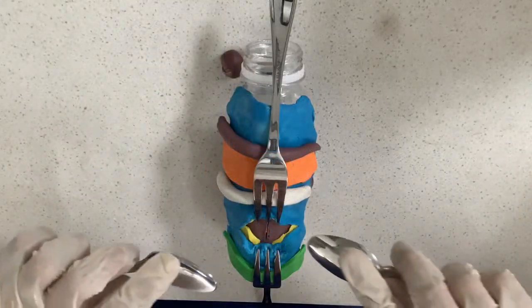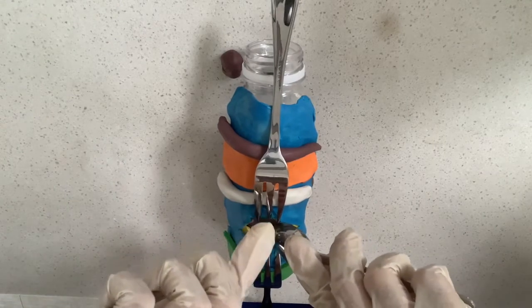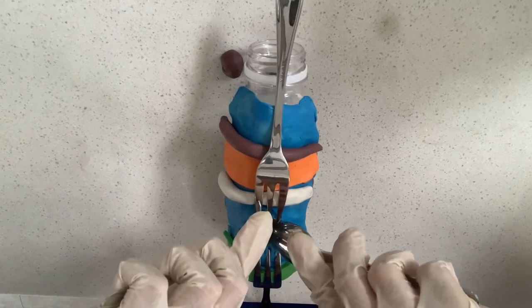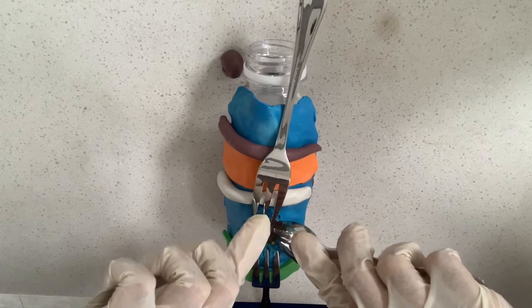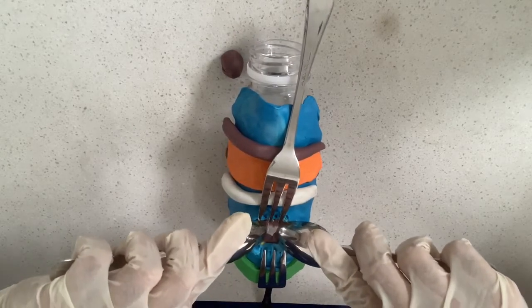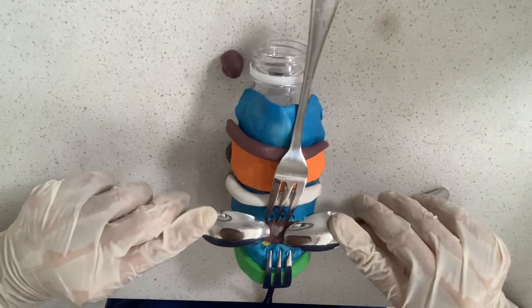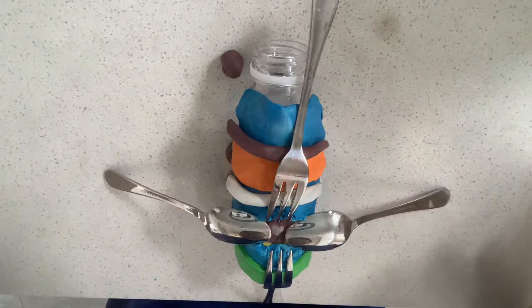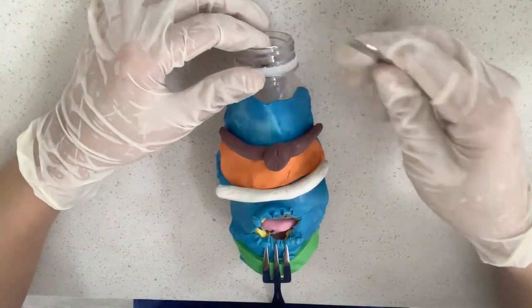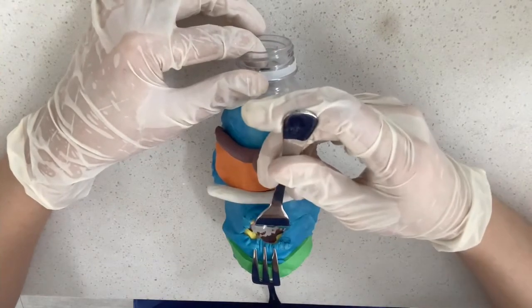You then identify the sternothyroid muscles and you retract the muscles laterally. Doing this, the trachea and cricoid can now be palpated. You retract the isthmus superiorly with Langenbach retractors to expose the trachea.